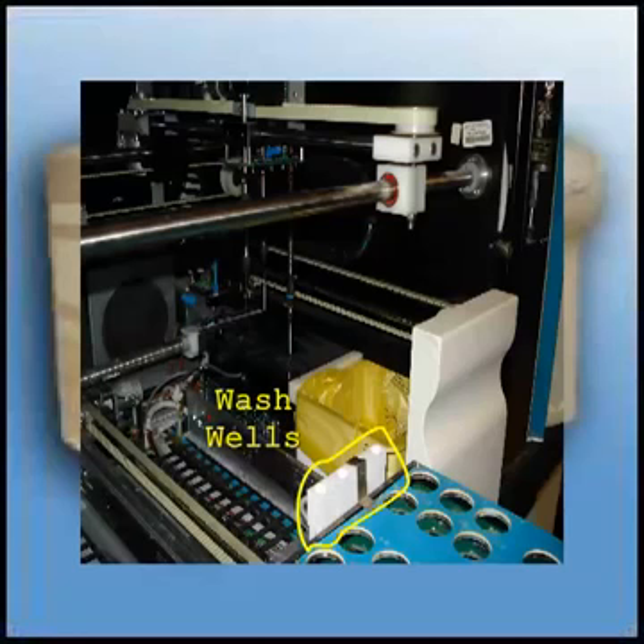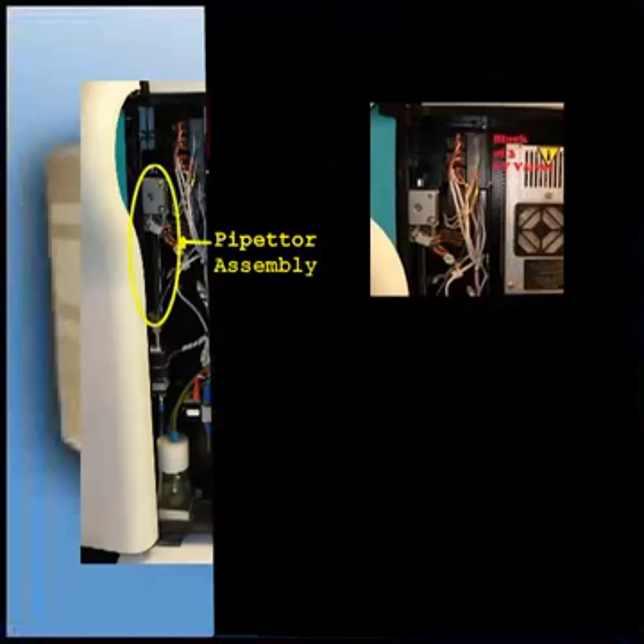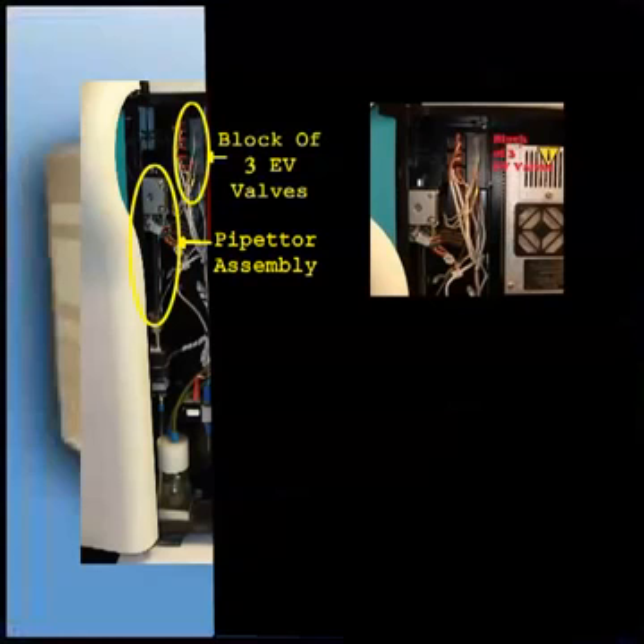The right side of the unit is divided into compartments. Each compartment supports different systems within the unit. The left section supports the fluidic system for the three needles. From the top down, you have a pipetta assembly which picks up the reagents and samples for needles number one, two, and three. A little to the right is the block of three EV valves, which control which needle is being used.